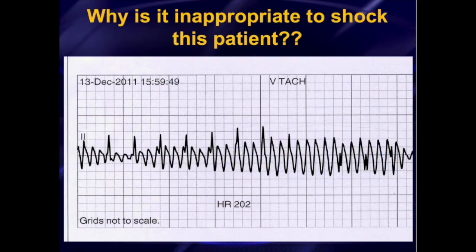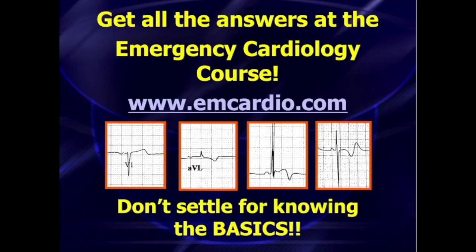For example, take a look at this. Even though the computer is calling this VTach, it's not VTach, and it's totally inappropriate to shock this patient. That's just a little smattering of what we're going to talk about. You're going to get the answers to these cases and a lot more.